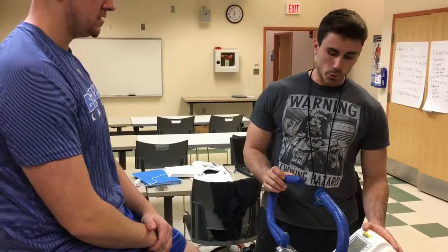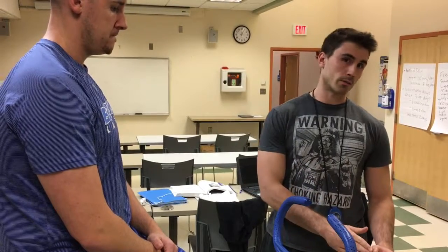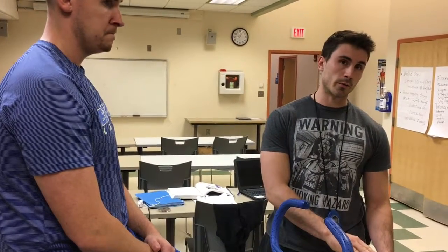We're going to do the Wingate warmup protocol. There are a few things we already took care of before we started this test. We got Jeff's weight — Jeff is 91 kilograms — and that's going to dictate the end weight for this protocol and also the starting weight for this protocol.